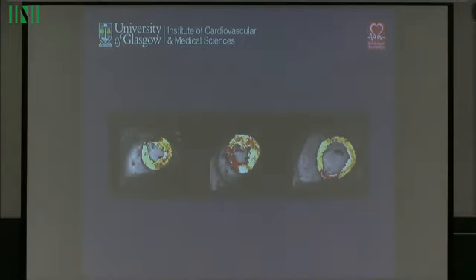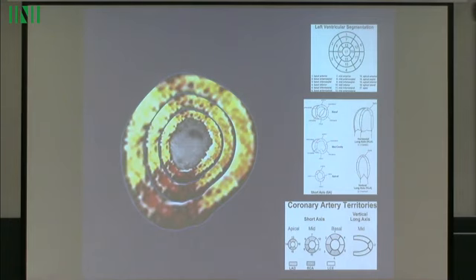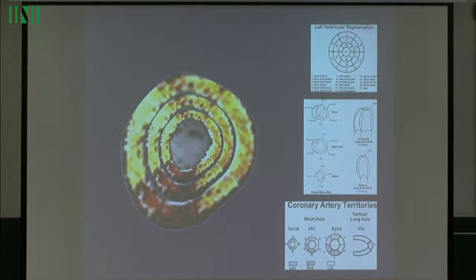So what happens? Basically, we get these beautiful complex images, then we have to divide them in these six sectors. Instead of trying to use either atlases or elastic deformation to map them to their natural state, but preserve their resolution. By preserving their resolution, interpolating them in an intelligent and robust way so that we retain our acquired resolution and never go below it.